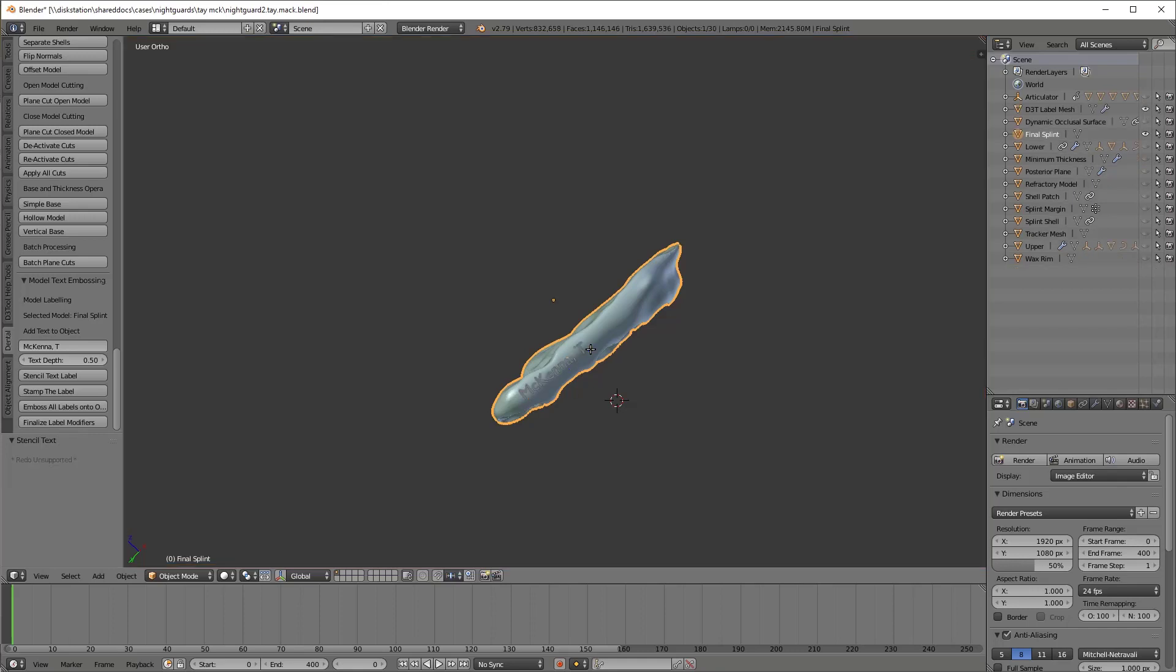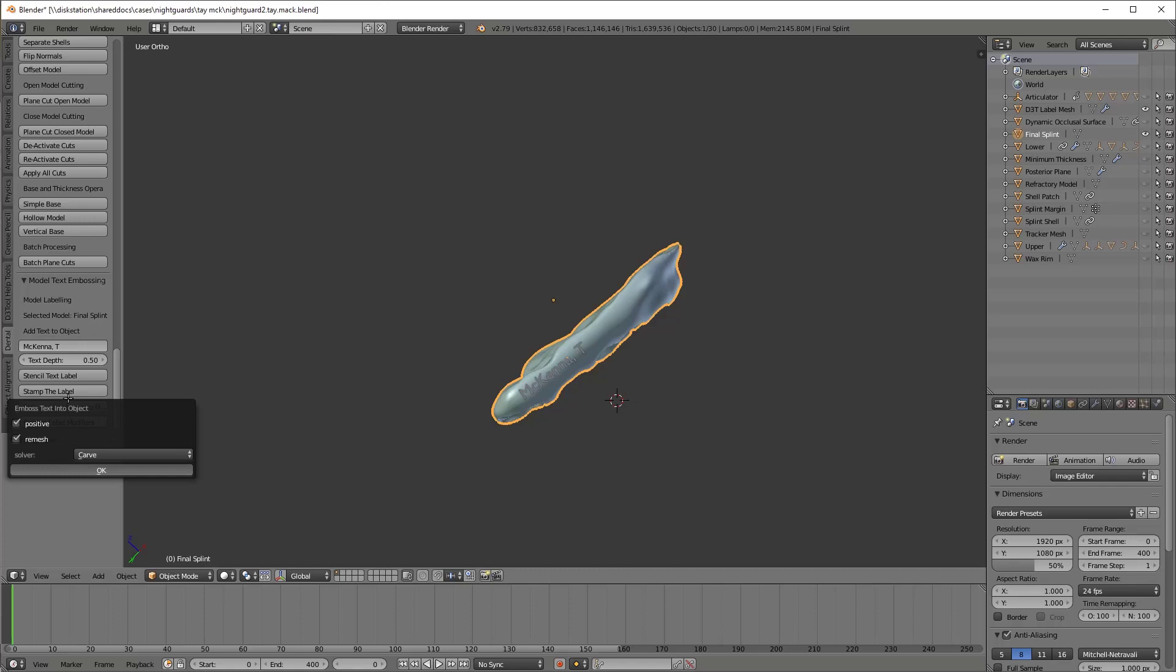So there we go. I'm going to emboss it. This operation is somewhat slow, but eventually it gets done. And then we'll go ahead and save the file, export it.